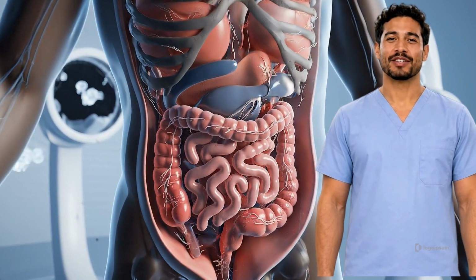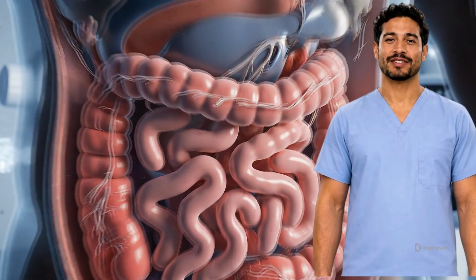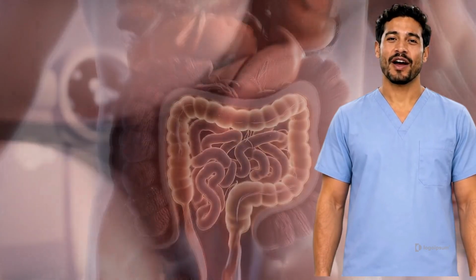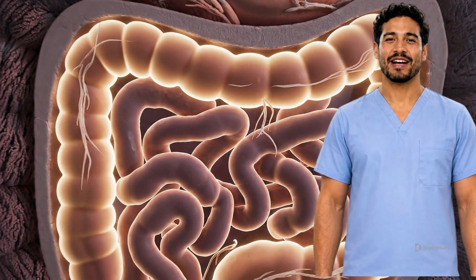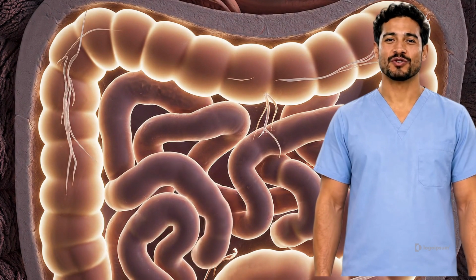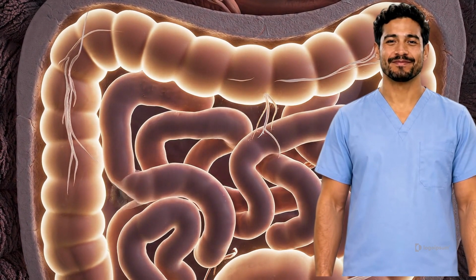For patients managing inflammatory bowel disease or Crohn's disease, MR enterography provides a comprehensive look at your entire digestive tract. While a colonoscopy evaluates the inner lining of the large intestine, it cannot reach most of the small bowel. MRE uses magnetic fields instead of radiation, allowing doctors to look through the outer bowel wall and surrounding tissue, making it ideal for young patients who need repeated scans over their lifetime.